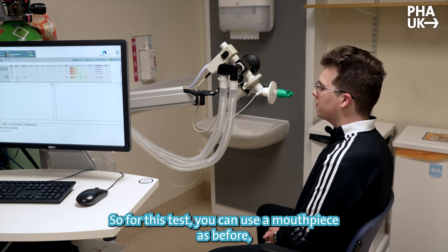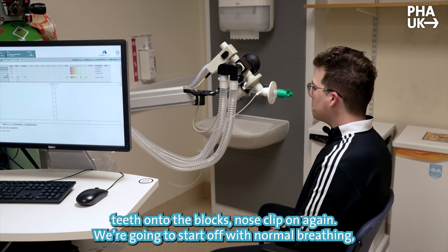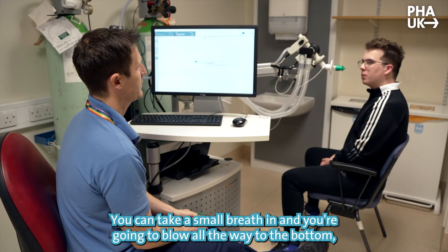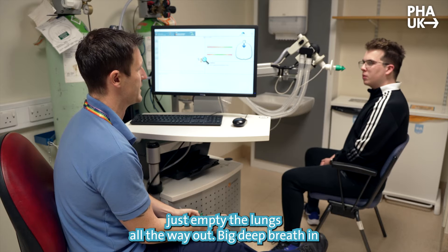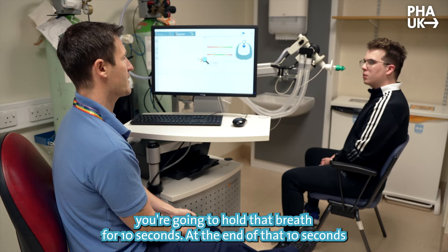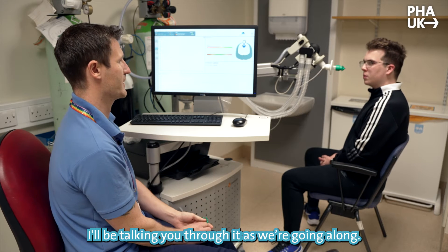For this test you're going to use the mouthpiece as before, lips right over the top, teeth onto the blocks, nose clip on again. You're going to start off with normal breathing, just in and out. You're going to take a small breath in and blow all the way to the bottom — just empty your lungs all the way out. Then take a big deep breath in as much as you can and hold that breath for 10 seconds. At the end of those 10 seconds, just gently blow it all the way out again. I'll be talking you through it as we go along.